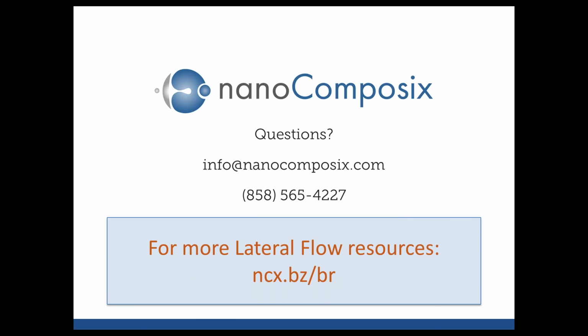Thank you, Steve. This question is from Gabriel. When is a passive conjugation a good option? Do you have any examples of that? It all comes down to empirically testing the antibodies. Depending on where the lysine residues on the antibody are, or how certain proteins fold and interact while they're in solution, will determine whether a covalent conjugation method is practical for that antibody. In some cases, it's just important to test both methods empirically and see what gives better results.